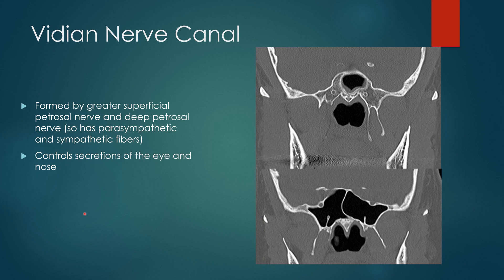The vidian nerve canal: the vidian nerve is formed by the greater superficial petrosal nerve and the deep petrosal nerve, giving it parasympathetic and sympathetic fibers that control secretions of the eye and the nose. To find it, go to a coronal view, look for the pterygoid plates, and find a small foramen just above them. This is the normal appearance of the vidian nerve canal — safe within the bone. A superficial positioning of the vidian nerve canal means it's on a little stalk, not covered by bone. If this patient had sinus surgery, it would be easy to inadvertently injure it hidden underneath the mucosa.